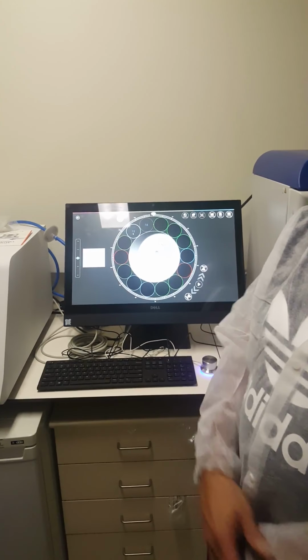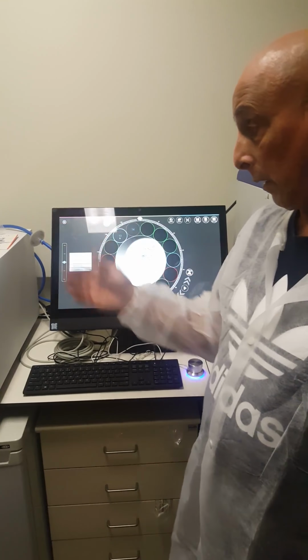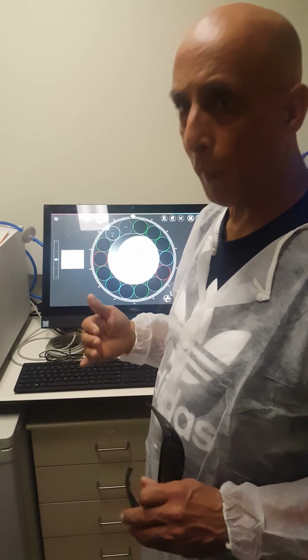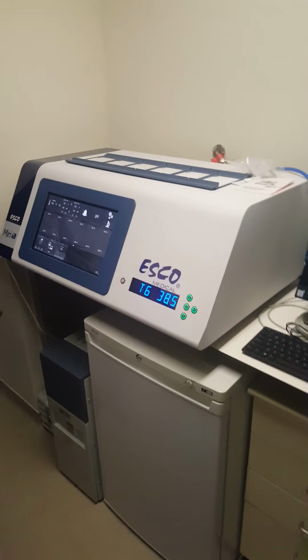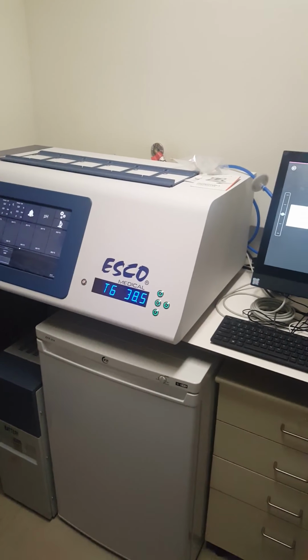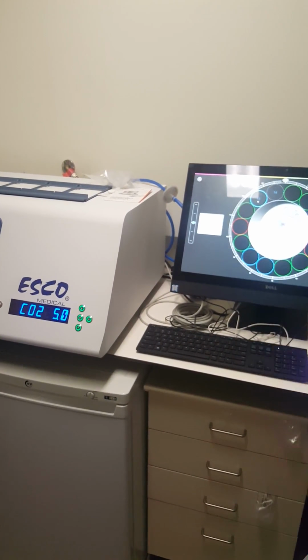Yeah. So it's a very, very practical facility for human IVF, but now we are using it for research. But it's very new, and we are just arranging our thoughts, and we got another PhD student from the IVF unit, so she knows everything about it, and she's going to do a PhD with this machine.